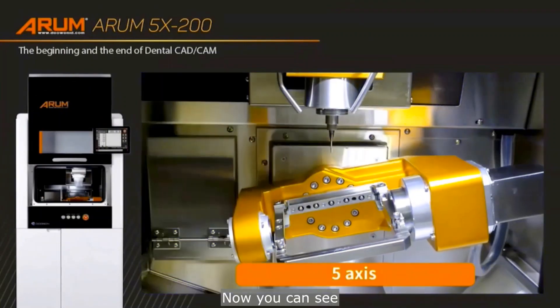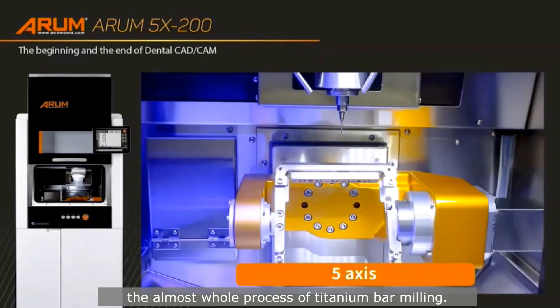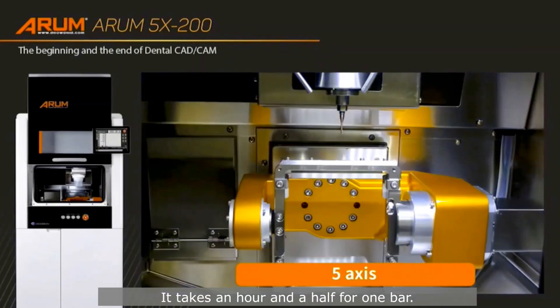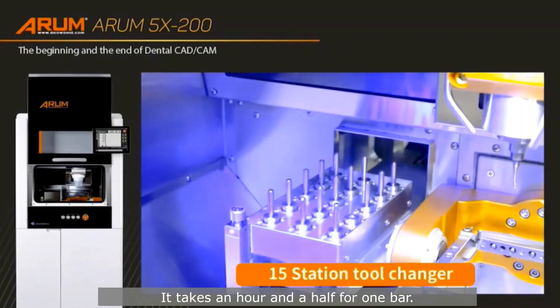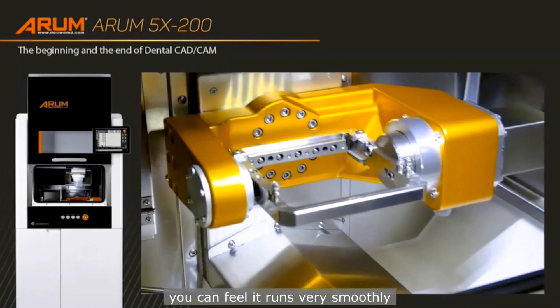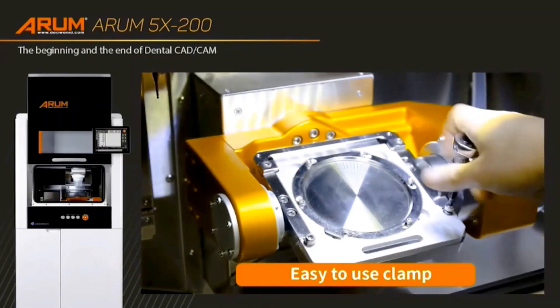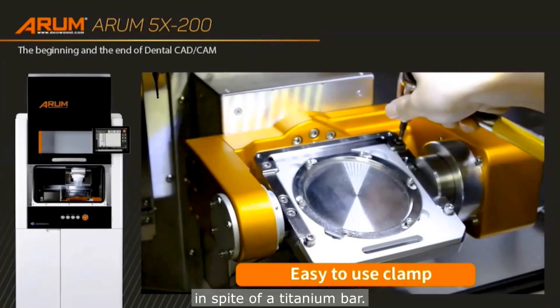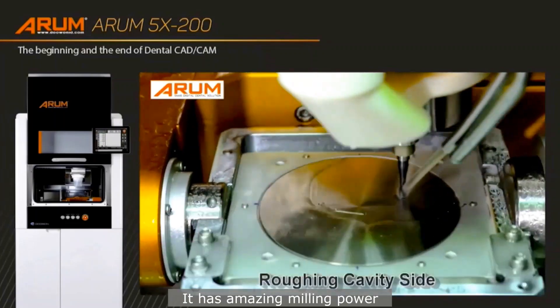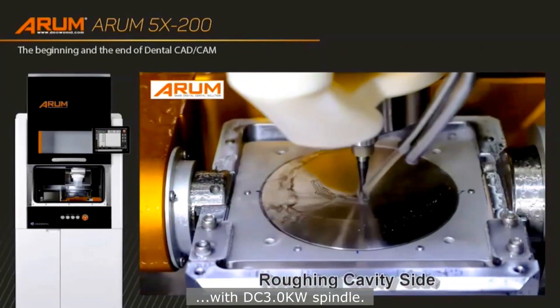You can see the almost whole process of titanium bar milling. It takes an hour and a half for one bar. If you just watched this video, you can feel it runs very smoothly in spite of it being a titanium bar. It has amazing milling power with a DC 3.0 kilowatt spindle.